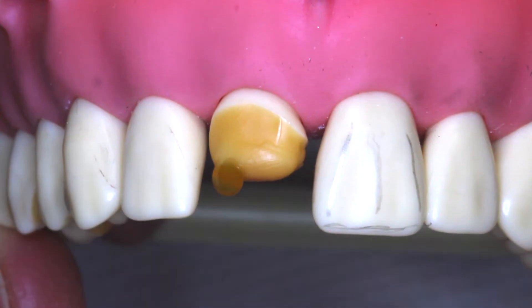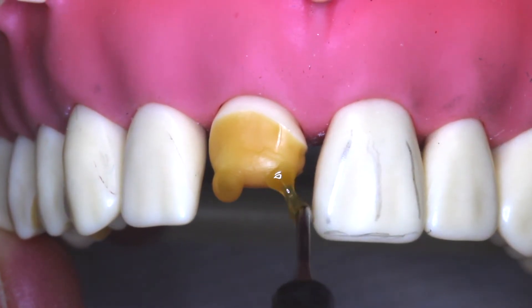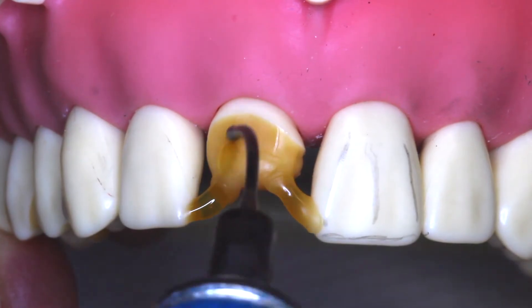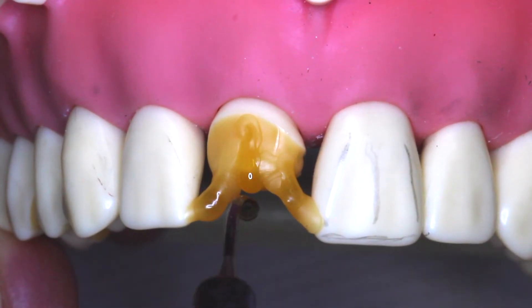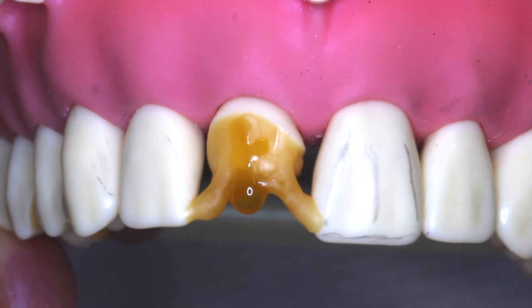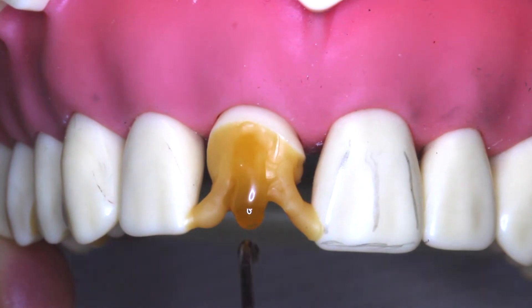Placing your number 8 stub back into your typodont, we can now begin to develop our anatomical features. The first thing we want to do is make two cones that reach up to the contact areas of our adjacent teeth. The cones need to be self-supporting because you will be removing this wax up. Now we're going to start the middle lobe of the number 8 central and reach up into the incisal aspect of the tooth. Our central incisors, if you notice on number 9, have three lobes and two depressions.